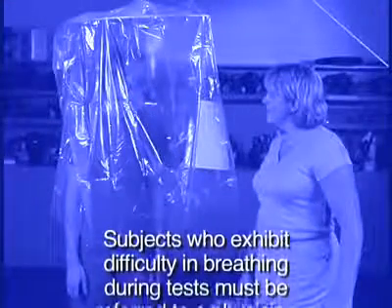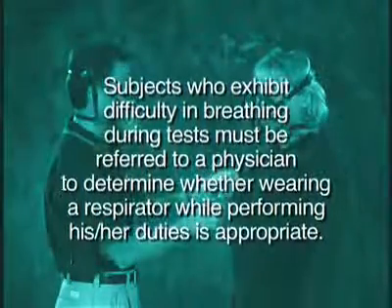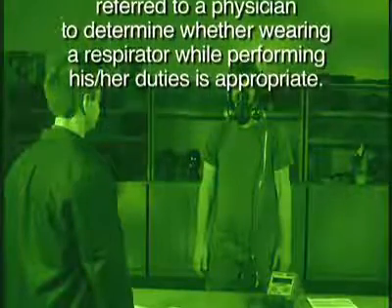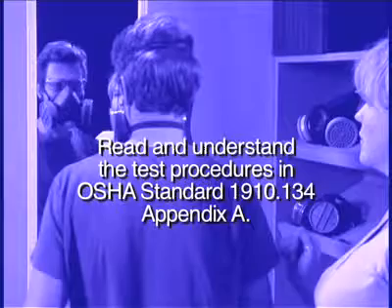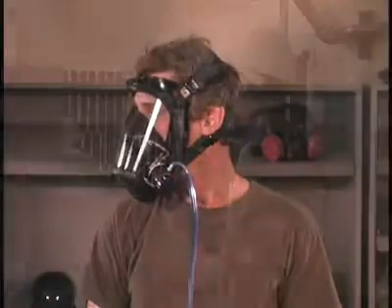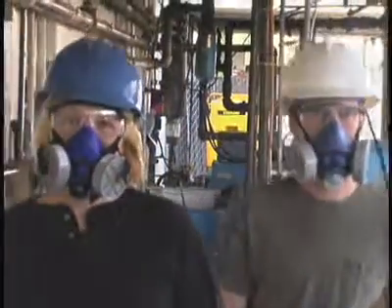Test subjects who exhibit difficulty in breathing during either of these tests must be referred to a physician trained in respiratory diseases or pulmonary medicine to determine whether wearing a respirator while performing his or her duties is appropriate. Before conducting fit tests, make sure that you read and understand the test procedures described in the OSHA Standard 1910.134 Appendix A. Fit testing, whether qualitative or quantitative, performs the vital function of making sure that respirator users are properly protected against hazardous substances in the workplace respiratory environment.